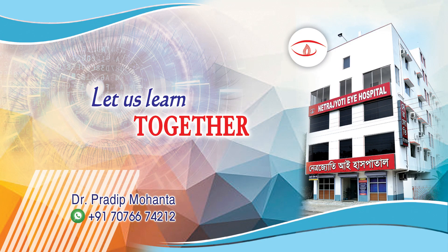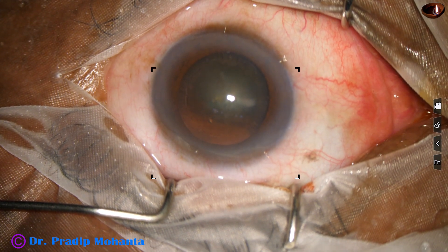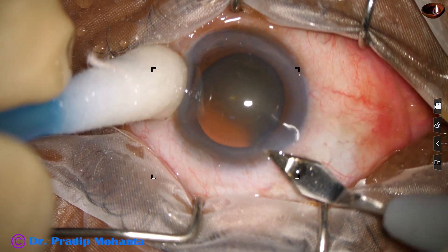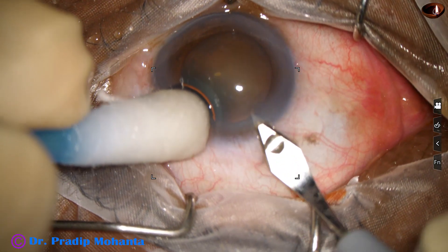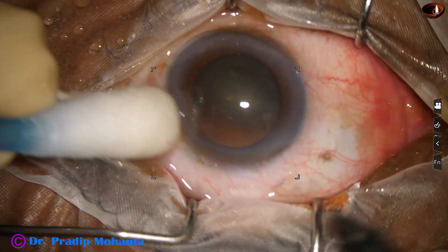Friends, welcome to my workplace for hands-on phaco and SICS training. Let us observe this surgery. This is phacoemulsification of a cataract — a soft cataract with pseudoexfoliation. This is a totally unedited recording and you are not missing anything.